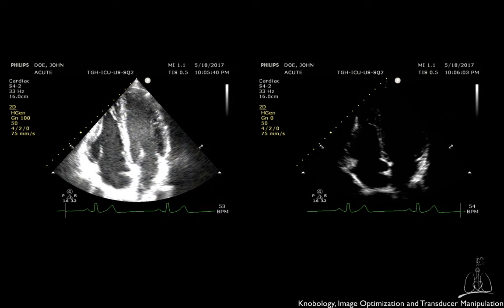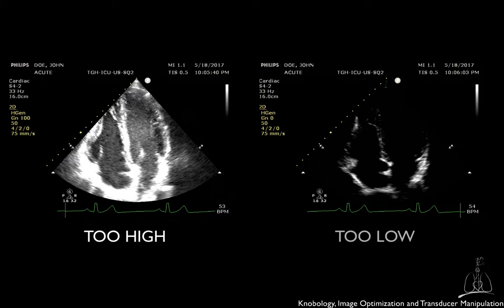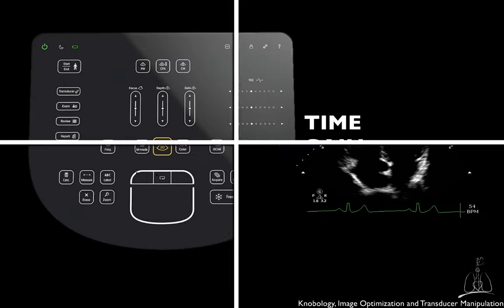These two images demonstrate how changes in gain alter brightness of the entire image. The image on the left is obtained with high amplification or gain, while the image on the right was obtained by reducing the amplification.